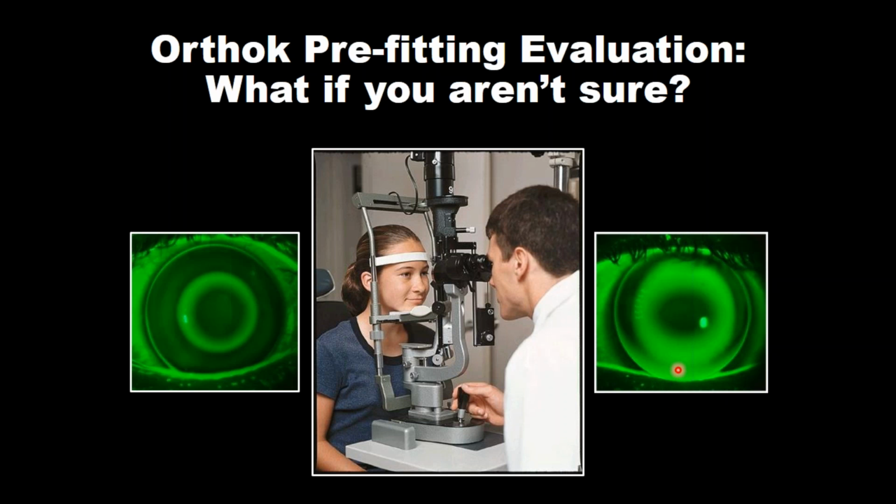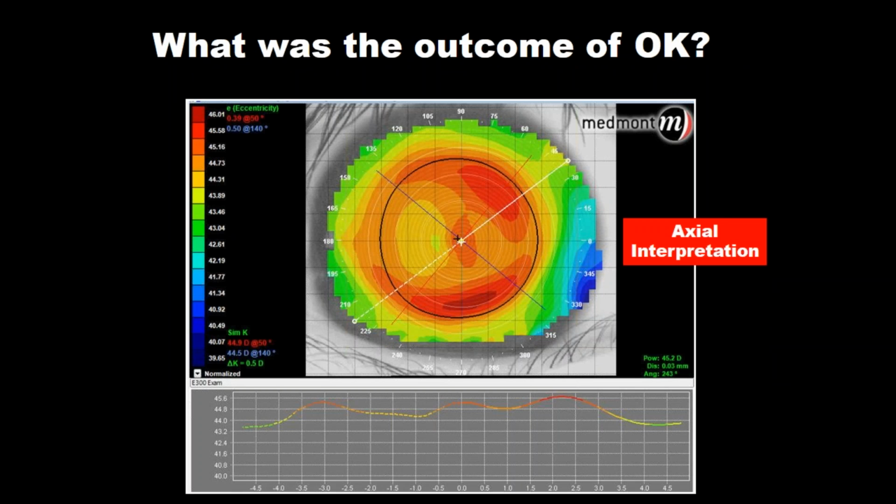Is this a patient who requires a CRT dual axis, a toric type lens? So if you're not sure of the pattern, but the comfort and the centration appear not too bad, then you might consider just doing an overnight evaluation. Always prove it out. So if you're not 100% with your fluorescein pattern analysis, don't worry, because the topography will confirm 100%.